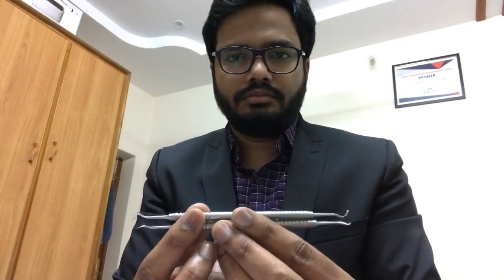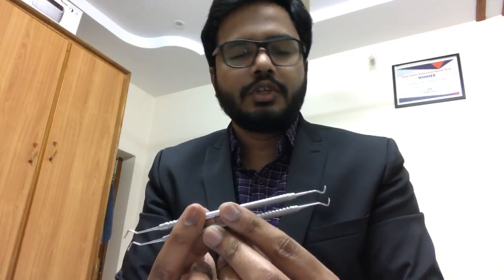So how do you identify a mesial GMT and a distal GMT? Of course, you might not have such a question from the exam point of view, but anyways, since we're discussing it, we have a right instrument and a left instrument, and we have a mesial GMT and a distal GMT. In these two instruments, which is right and which is left, and which is mesial and which is distal? How do you identify them? Do you have right and left in a single instrument, or mesial and distal in a single instrument?